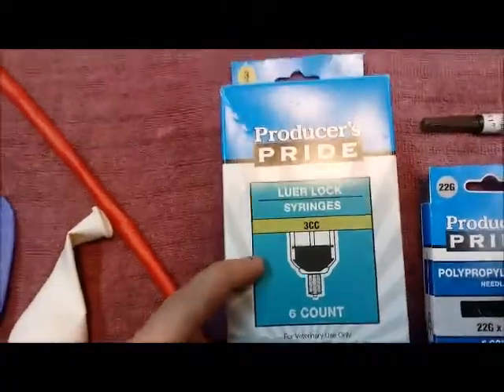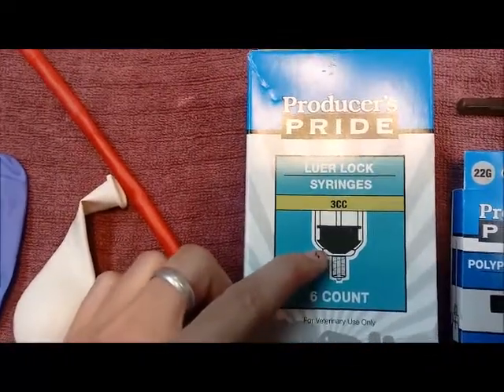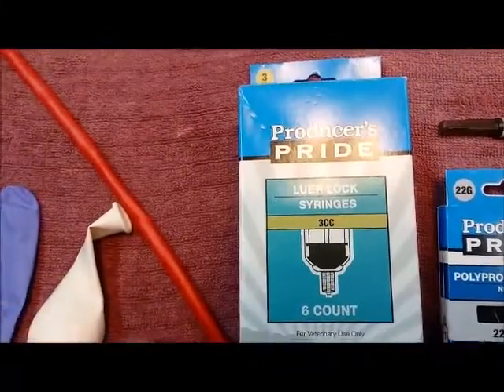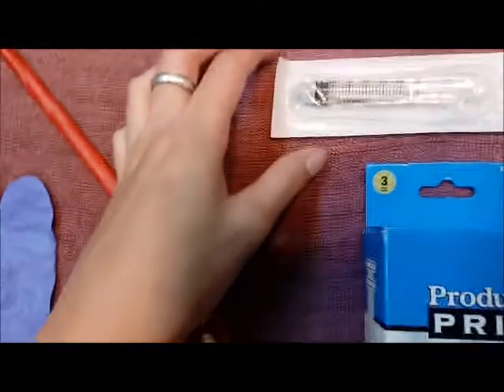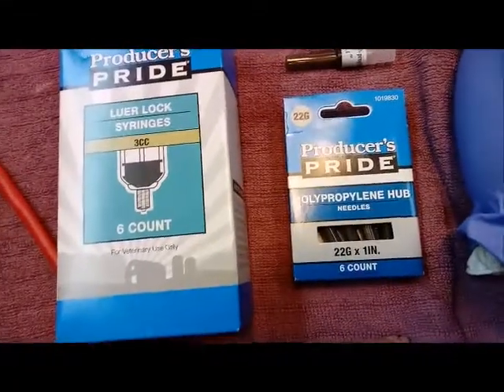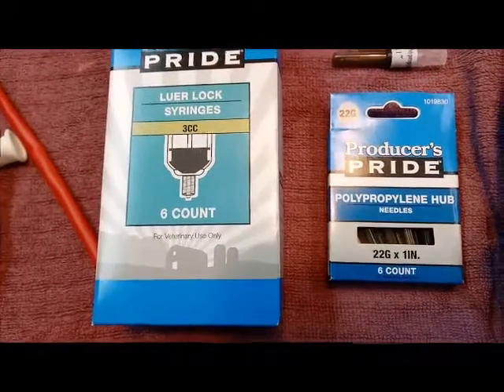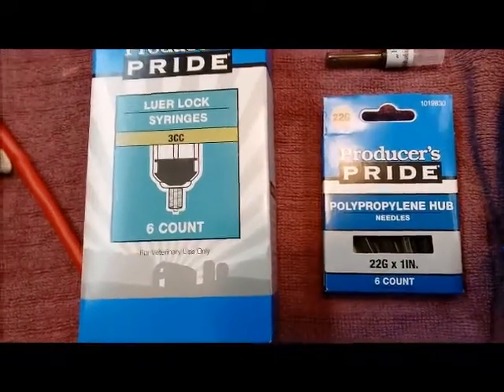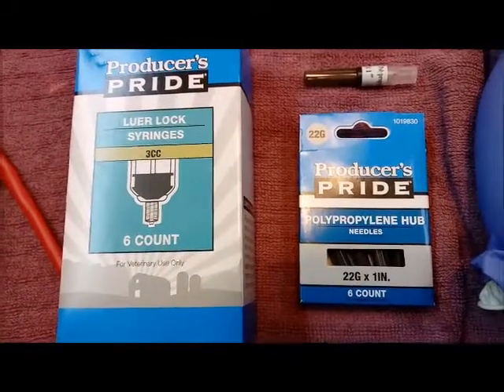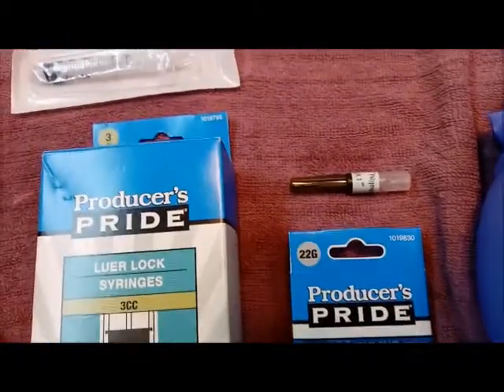Definitely get Luerlock syringes. It helps keep the needle in place because if you just get the standard syringes, the needles can pop off really easily. I usually just use a 22 gauge. When you're placing a catheter, typically it's going to be 22 or 20. If you can place a catheter with an 18 gauge, I guarantee you, you'll be the vet's best friend — that's the larger of the needles, and they'll love you for it. But to practice, I would say practice with a 22 gauge.